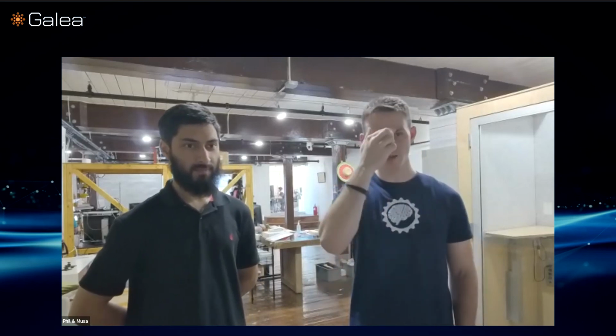Yeah, for the facial movement demonstration that we showed today, those are primarily based on muscle movements, particularly the muscles right here, and then the eyebrow muscles as well. Those are really loud signals, so it just makes sense to use them because they're very easy to detect, and they work really well for these movements and detections.